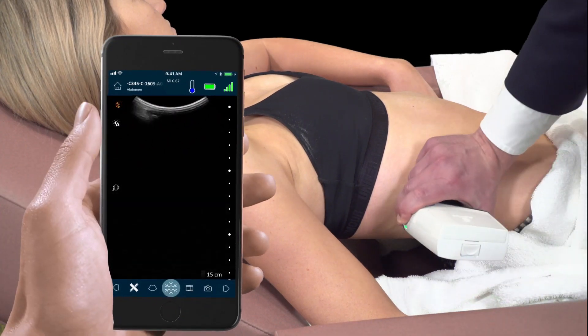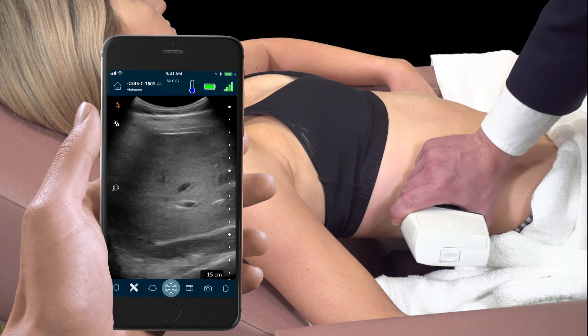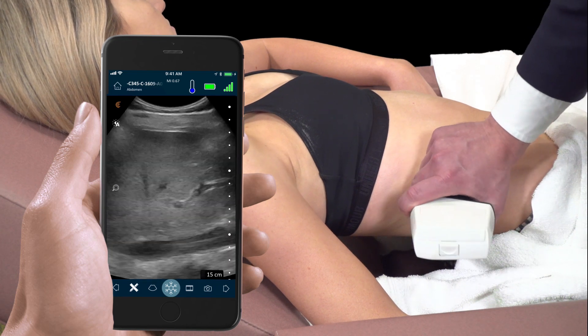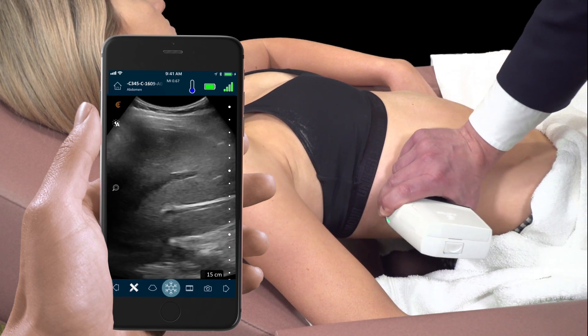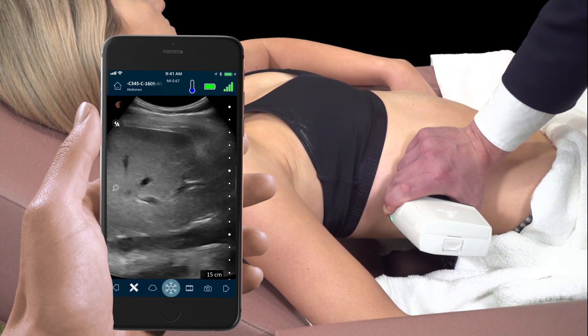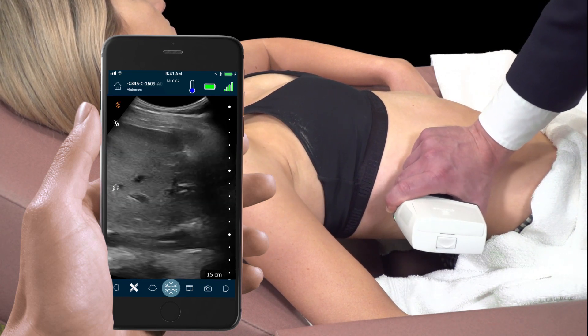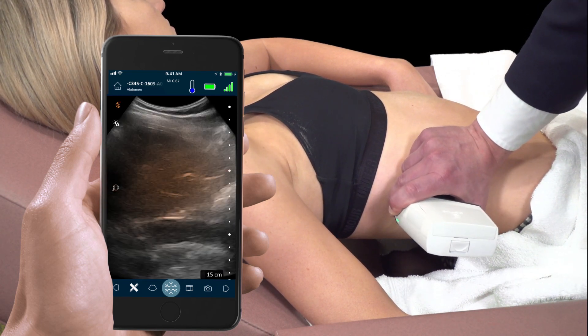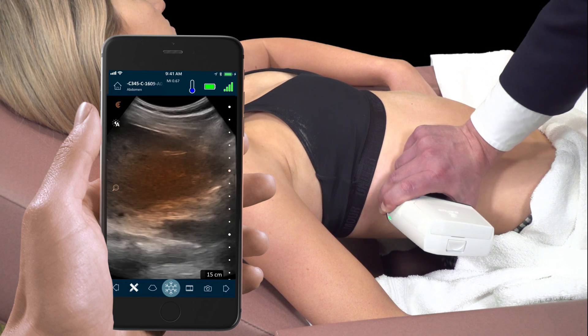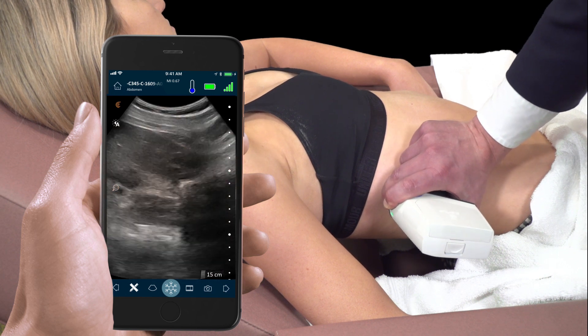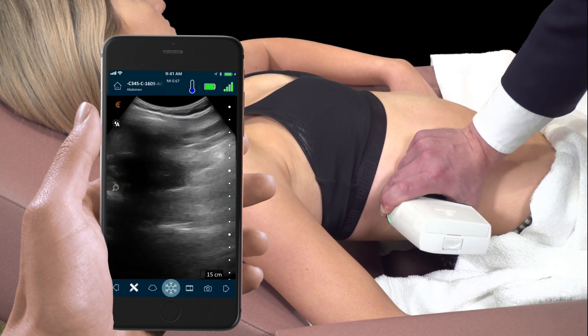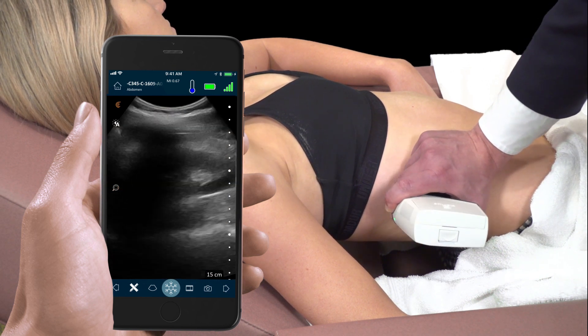With the patient lying supine, we place the scanner on the lateral aspect of the abdomen. Here we'll use the liver as an acoustic window to best view the right kidney.